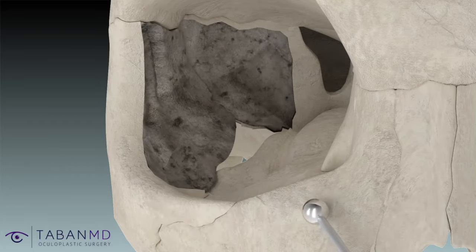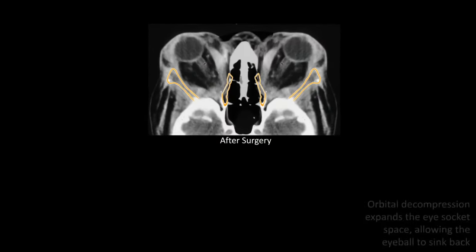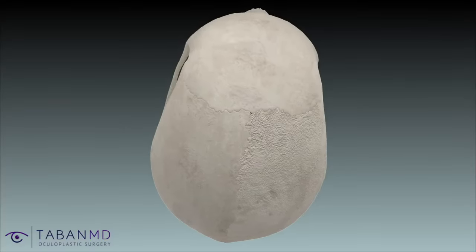A CT scan shows the expanded eye socket after orbital decompression surgery, making more room for the eyeball to sink back, thereby reducing bulgy eyes and restoring a more natural eye shape and size.